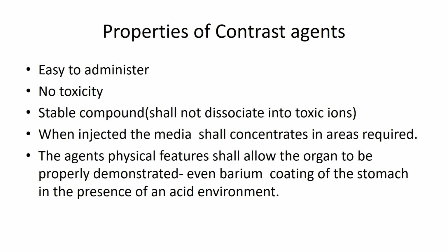If we have to see how a contrast agent needs to be, the first thing we should know is that any contrast agent that we utilize shall be easy to administer. It shall have no toxicity to the patient or produce no other alteration in the biological system. At the same time, the chemical used as a contrast agent shall be a stable compound.